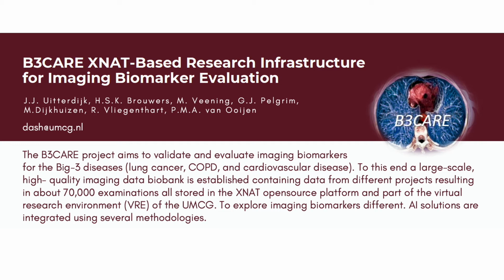The main component in this B3CARE environment is the XNAT open source platform that acts as the imaging data biobank that will eventually contain over 70,000 examinations as part of this project.